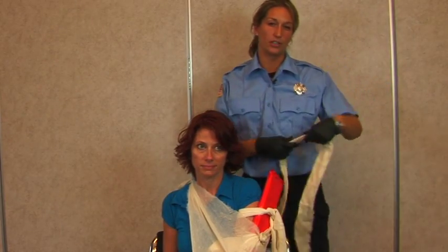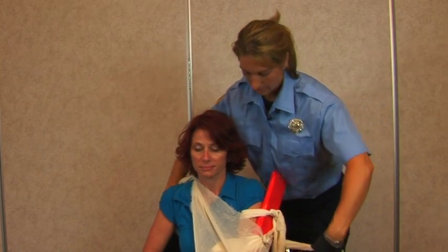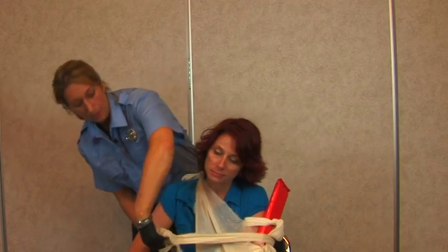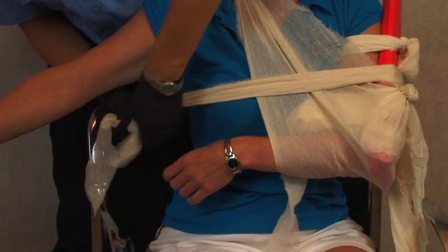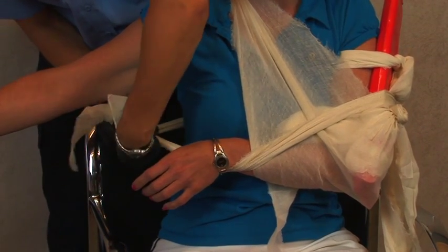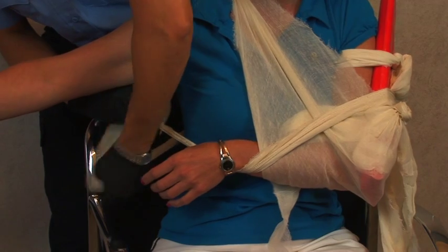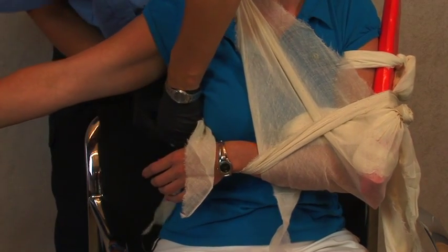Another way to ensure that the arm is going to stay in place is by applying the swath. All you need to do is wrap it around the patient, and if this does not hurt the patient, you can actually cradle their hand with it. Make sure you tie the knot on the uninjured side.